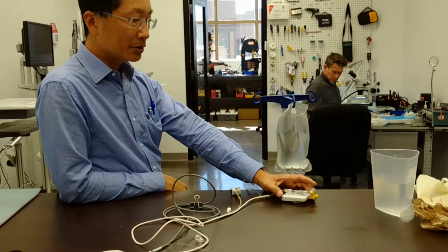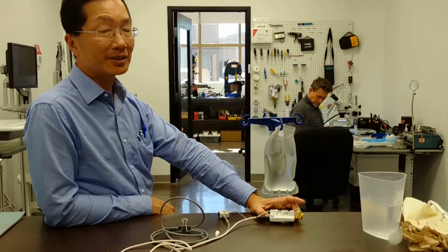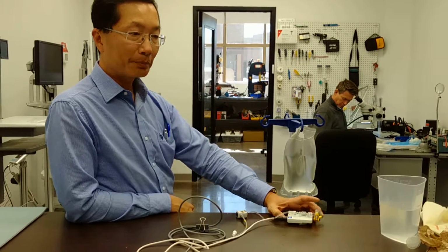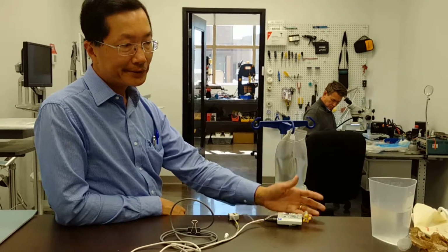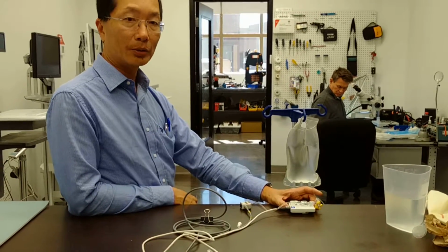Okay? If we're going to argue about the location of symphysis pubis, that's going to be another problem. It'll be another topic. However, we are basing on good urodynamic practices from the ICS guidelines that there is a clear understanding as to how that's done. So let's assume that's done in the correct location.